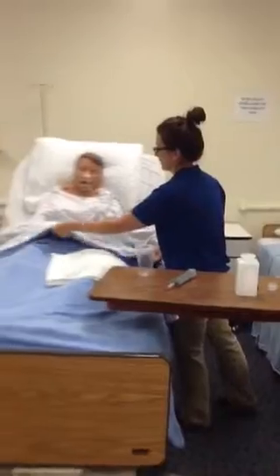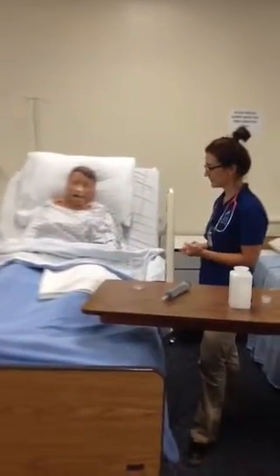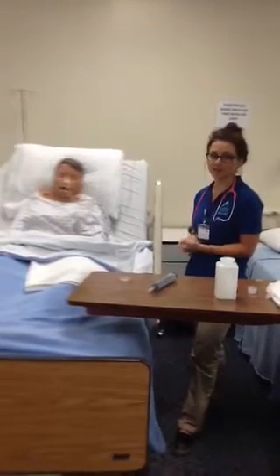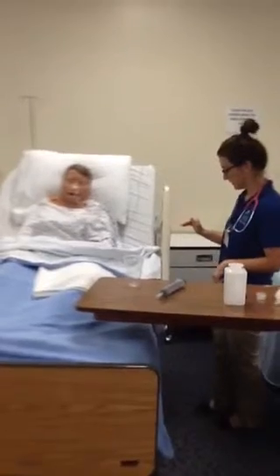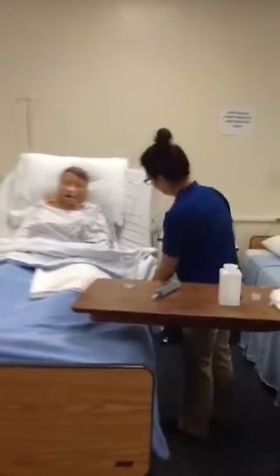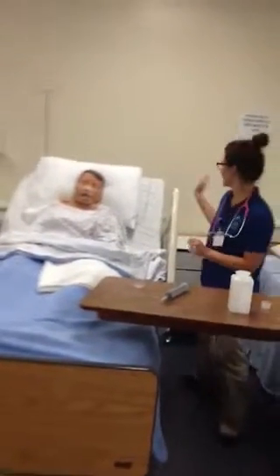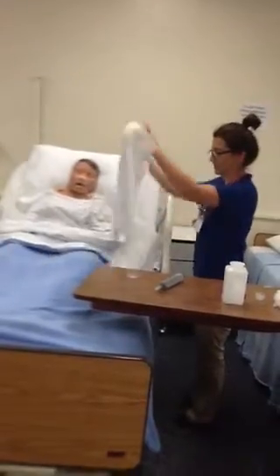Yeah, I'm not feeling well. Can you state your name? Mitchell Wilson. Okay, and your date of birth? 7/27/54. Okay, so I have verified Mr. Wilson's date of birth and name against his wristband for safety precautions. Now I'm going to place the bed in a semi-Fowler's position. Okay, and I'm going to disconnect the nasogastric tube from suction. Let me put his towel on first.